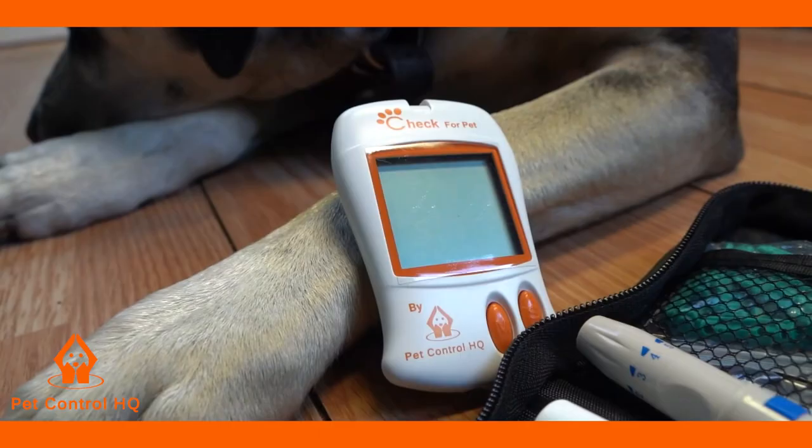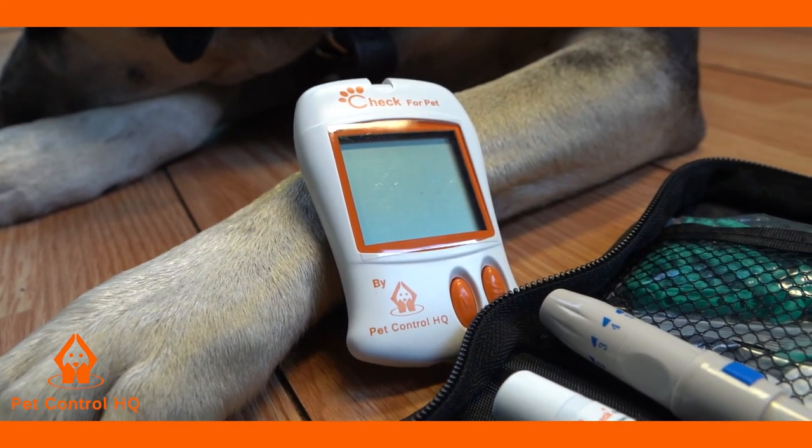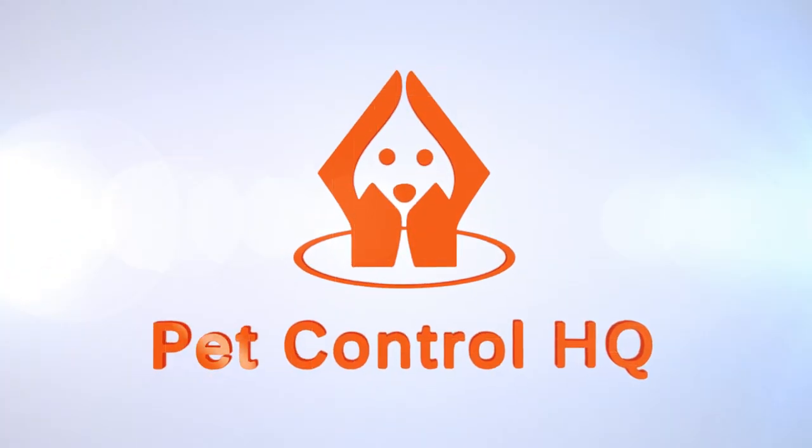The monitor will turn off automatically. You can now proceed with doing a glucose test.